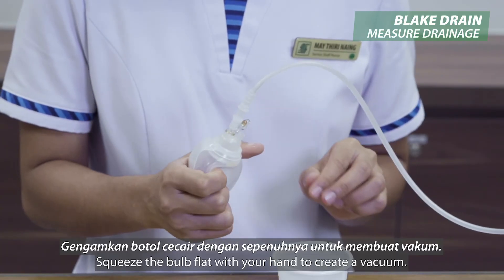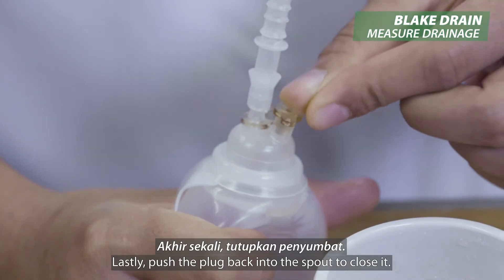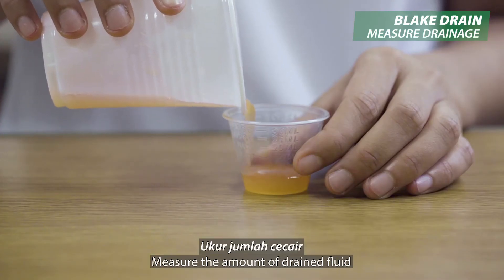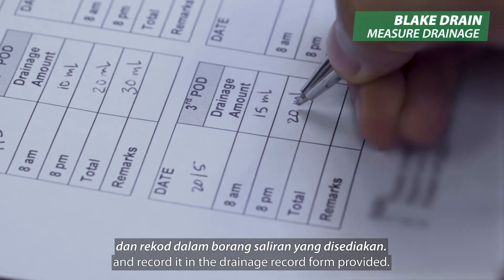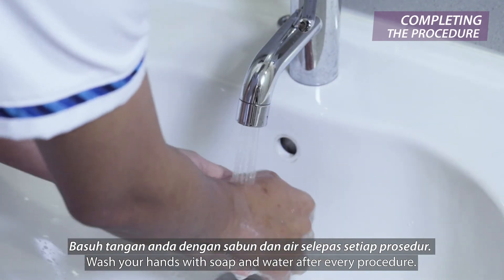Squeeze the bulb flat with your hand to create a vacuum. Then push the plug back into the spout to close it. Measure the amount of drained fluid and record it in the drainage record form provided. Wash your hands with soap and water after every procedure.